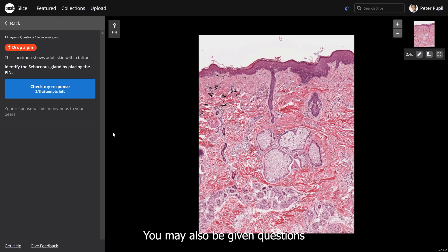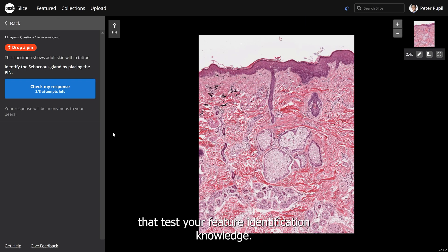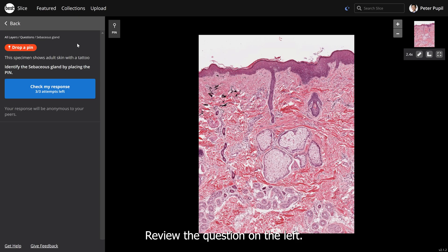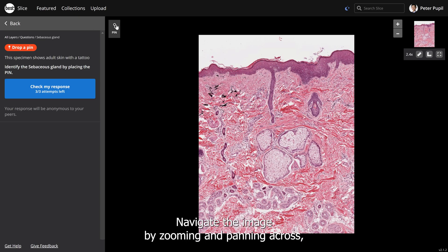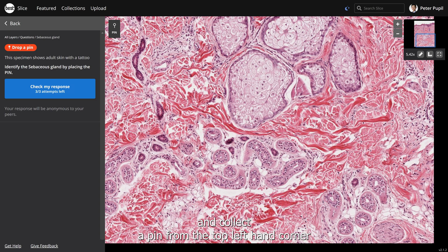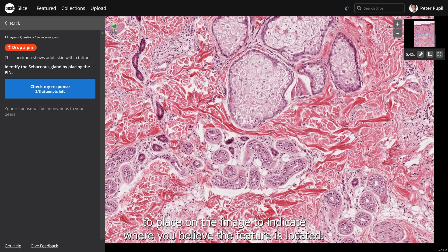You may also be given questions that test your feature identification knowledge. Review the question on the left, then navigate the image by zooming and panning across, and collect a pin from the top left-hand corner to place on the image to indicate where you believe the feature is located.